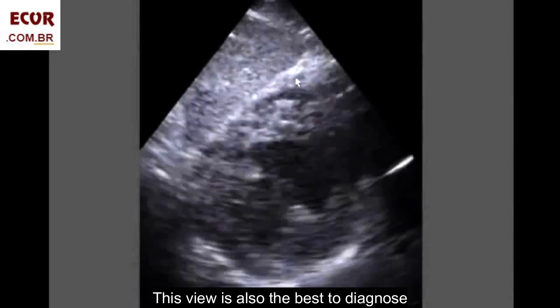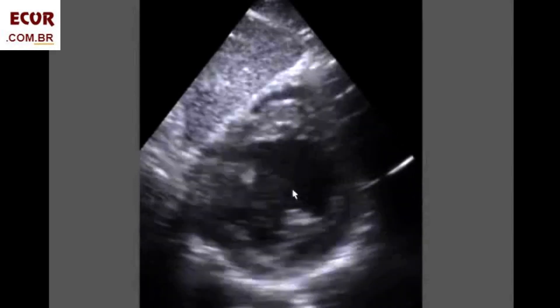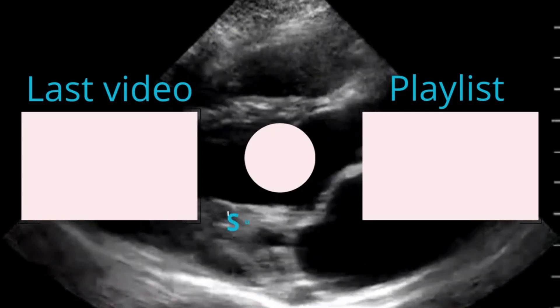This view is also the best to diagnose infarction of the right ventricle. The wall here is contracting well.